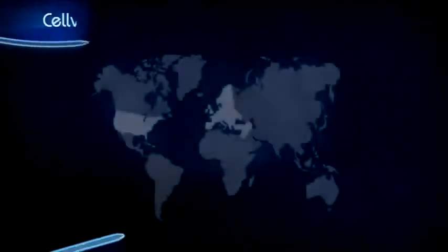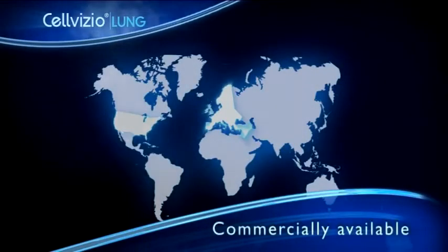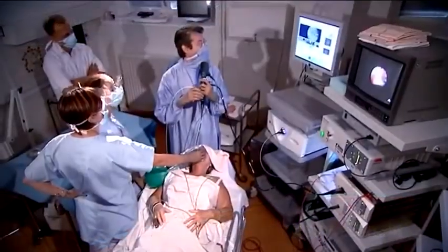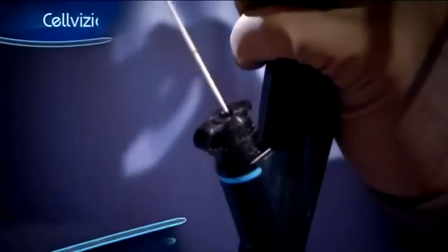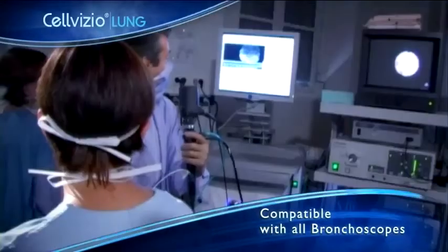Cellvizio Lung has the CE mark in Europe and is FDA cleared in the United States. It is commercially available both in Europe and the US. The alveoscopy procedure requires only brief training. No additional preparation of the patient is needed. The AlveoFlex is compatible with all manufacturers' existing bronchoscopes operating channels.